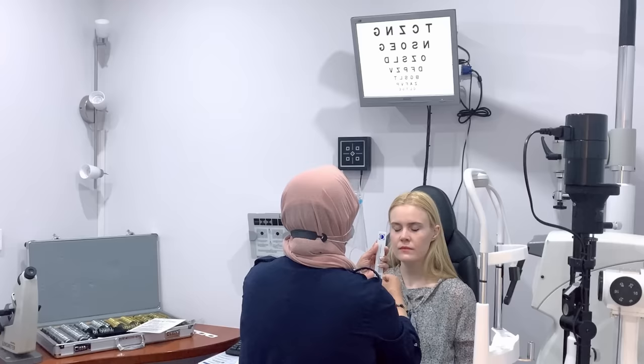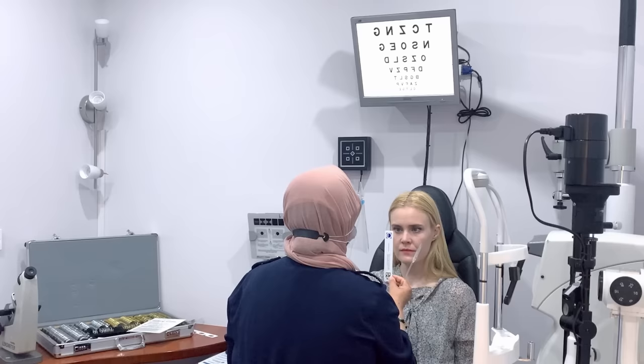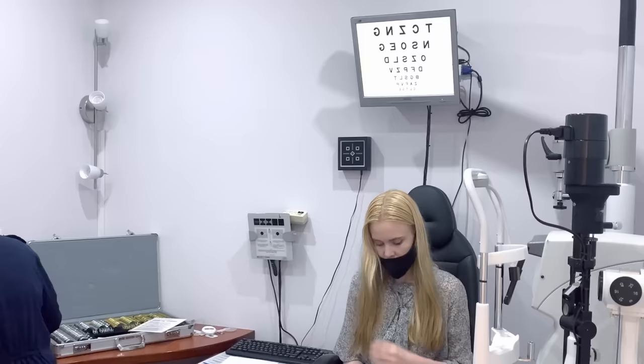And blink. Good. Now watch the letter E. Concentrate on the E. Concentrate on the E. Well done, well done, well done. Perfect. That's great. Thank you. Thank you. I'm going to get you to just look at my light, okay?